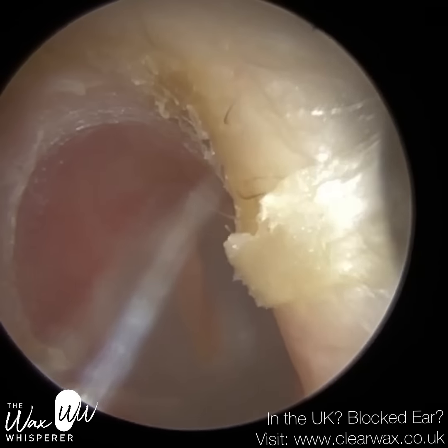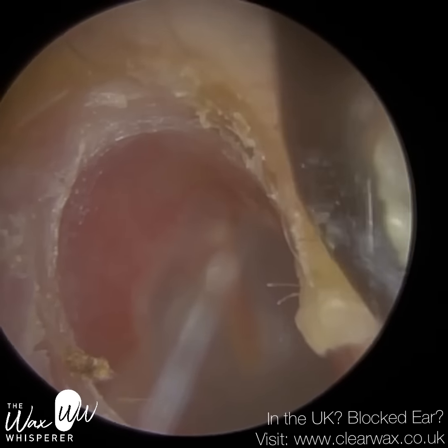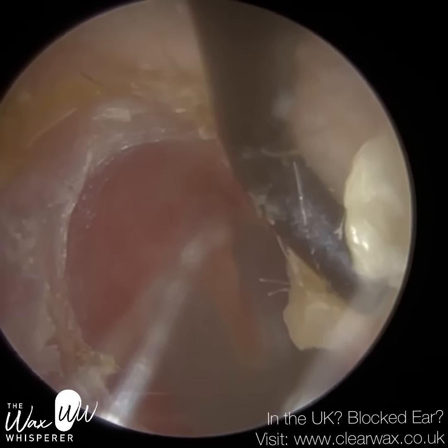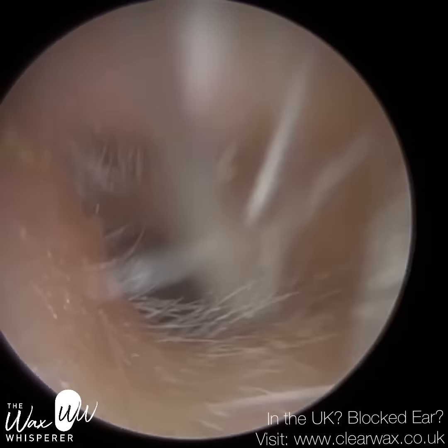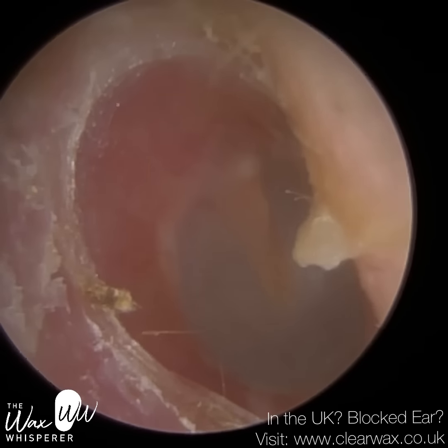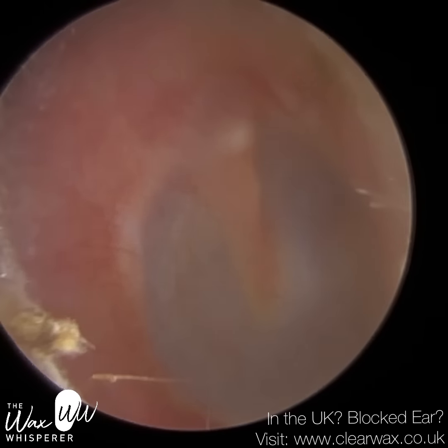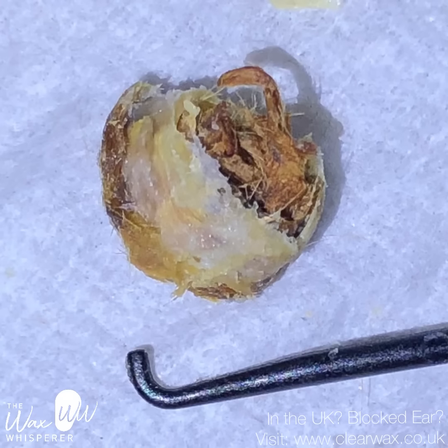The absence of a light reflex doesn't always mean that you've got an unhealthy eardrum, but it's just one of those landmarks that we quite often look for. More often than not, if it is present, then it means you've got a very healthy eardrum. Again, it's just some dead skin on the side. I just removed that using the elbow of the St. Bart's hook, and you can see a nice still image.